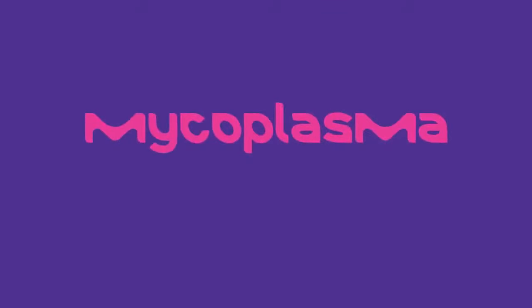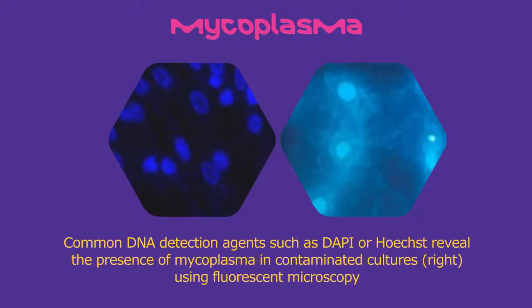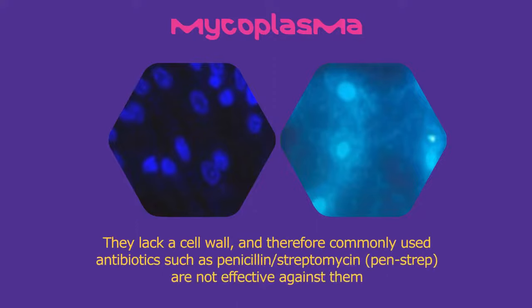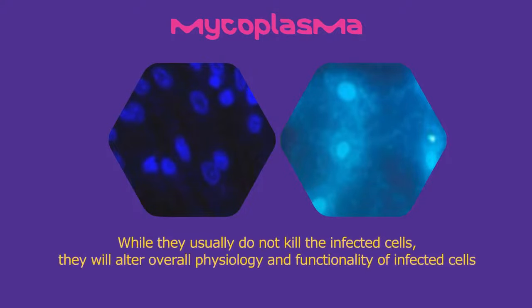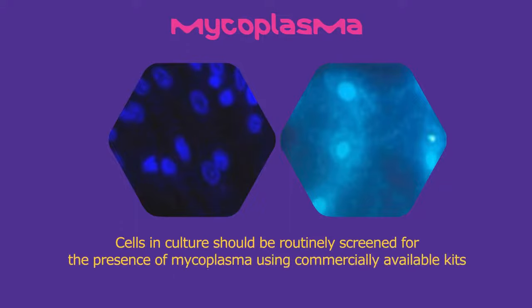One particular contamination I would like to call out is mycoplasma, which is often called the silent cell killer. Mycoplasma is a sub-micron sized bacterium and therefore cannot be visualized under routine microscopic monitoring. Due to their small size, they can easily attain a concentration of about 100 million bacteria per milliliter without causing turbidity of the medium. They lack a cell wall, and therefore commonly used antibiotics such as pen-strep are not effective against them. While they usually do not kill infected cells, they will alter the overall physiology and functionality of infected cells. If you notice your cells are not behaving in the expected manner, such as slower growth or change in morphology, it would be a good idea to test for the presence of mycoplasma through commercially available kits.